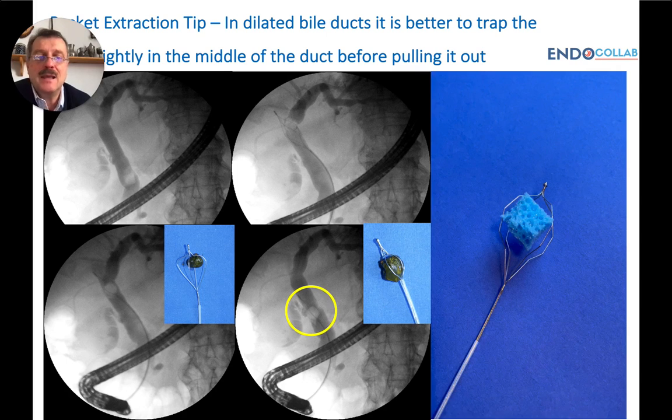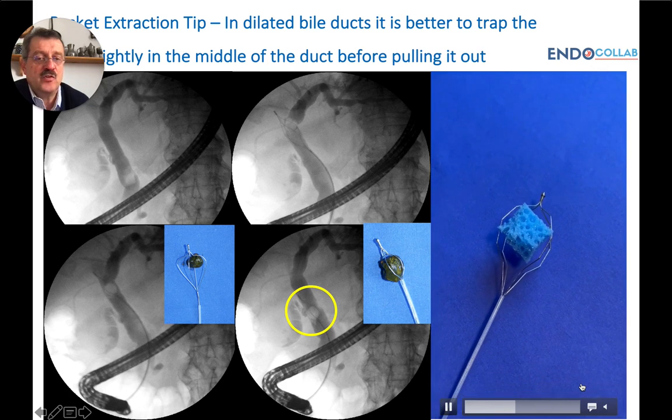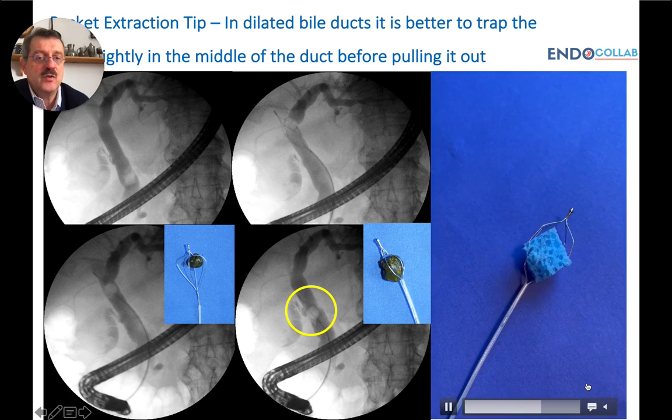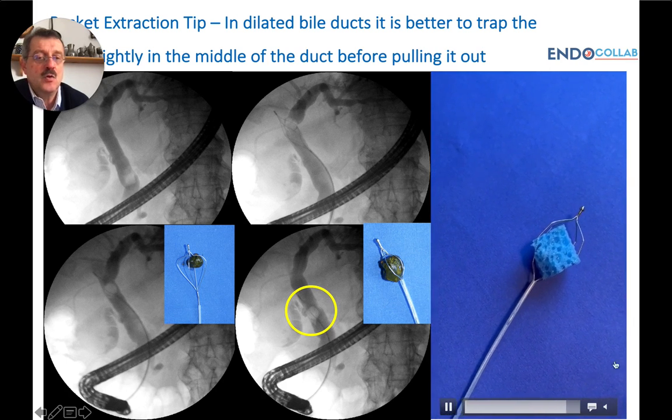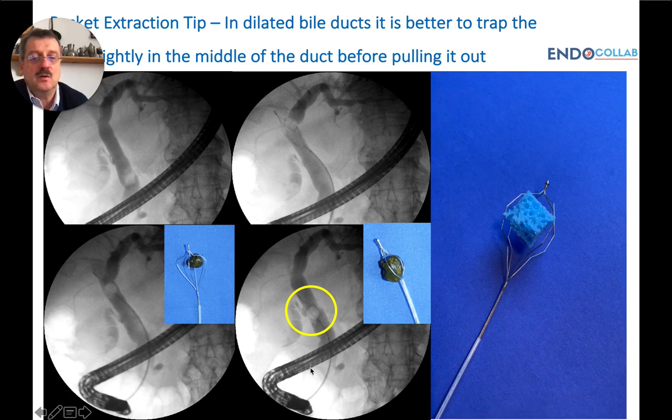So when you are working with the stone and getting it tightly into your basket, it's better to do it in the more middle or distal part of the dilated bile duct. First, pull the stone, and once you're in the middle of the bile duct, close and grasp it nicely, then pull out of the bile duct.